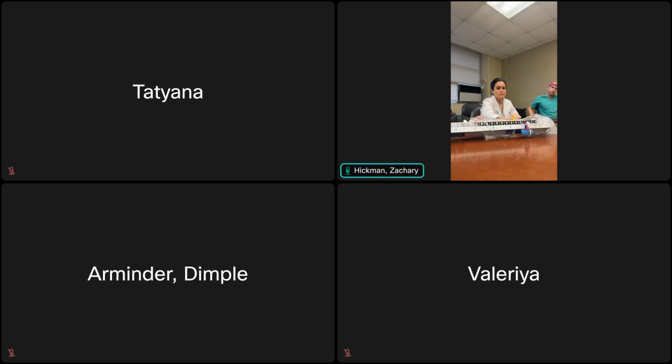So the things you need to have in line at any one time are the red 0, and then the transducer needs to be in line with that 0, and both need to be in line with the external auditory meatus or the tragus, whichever you're using as a 0 point. And then basically you're opening the transducer to air.